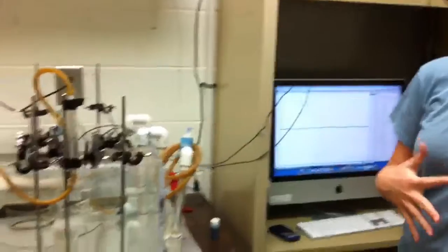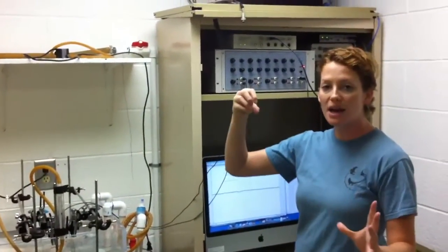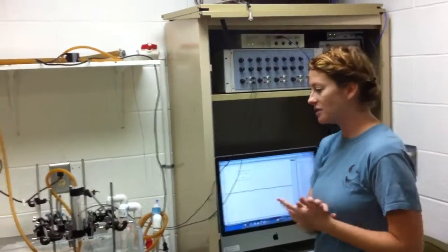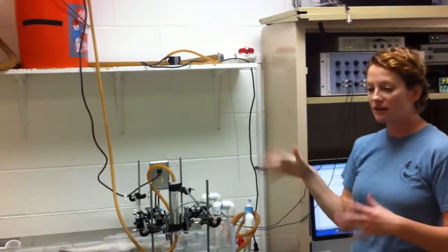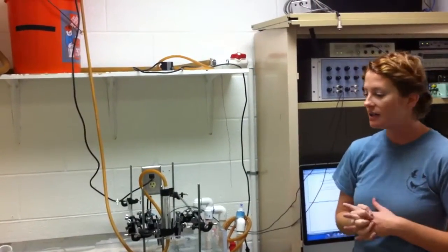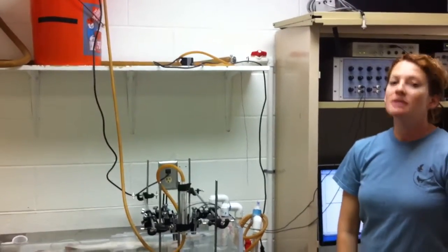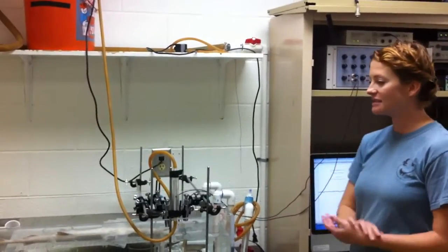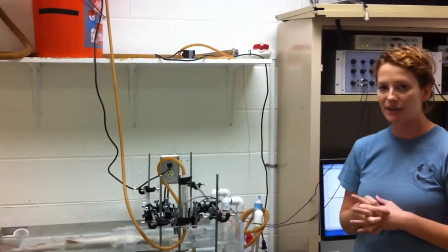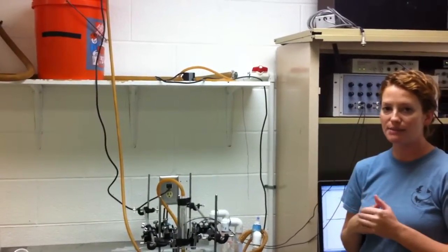So you have to do that for a half an hour. Just switch the background to seawater, let all that clear out of the nose, let the odors become unbound from the receptors and wash away and down the drain. And then I'll confirm, by testing these odors over a background of seawater, that they can respond at a normal level again. So that's what I'm doing at the moment, just waiting for the nose to unadapt, to come out of the perfume store. You spend a lot of time waiting for the sharks to clear out. Yeah. Unadapting takes, I let it go for about a half an hour, and then when I adapt with something, I let that strong odor wash through the nose for at least 10 minutes before I start testing things.